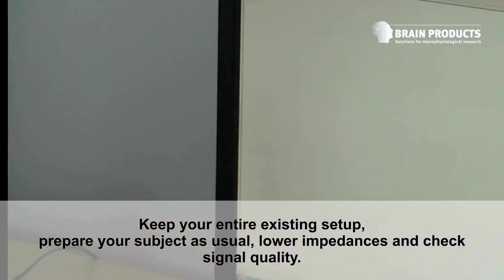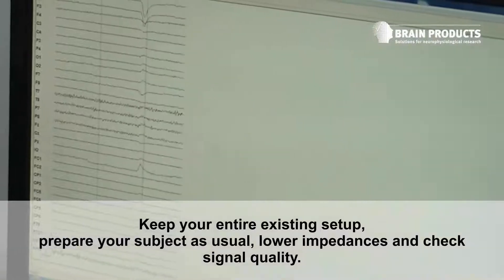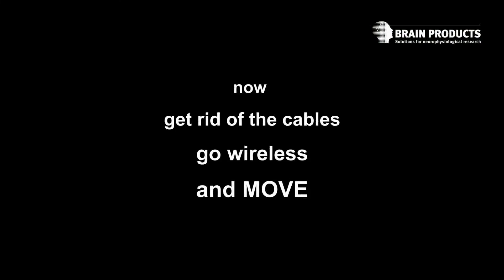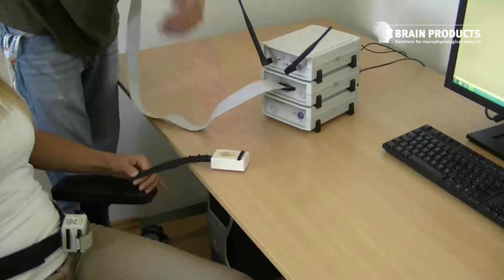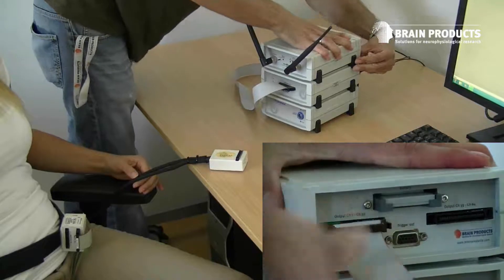Lower impedances and check signal quality. Just before you're recording, replace the wire between electrode cap and amplifier. Connect the electrode cap to the MOVE transmitter and connect the MOVE receiver to your amplifier.